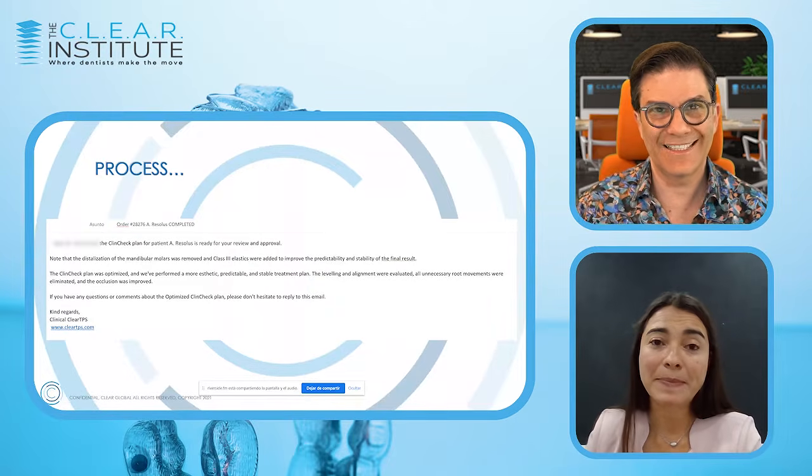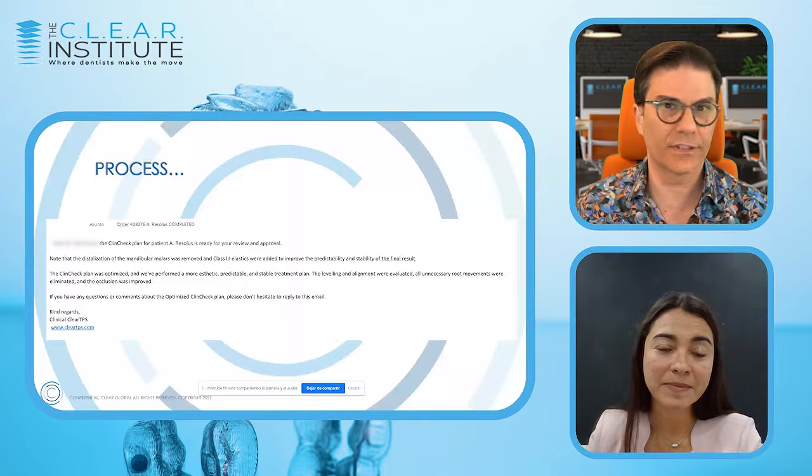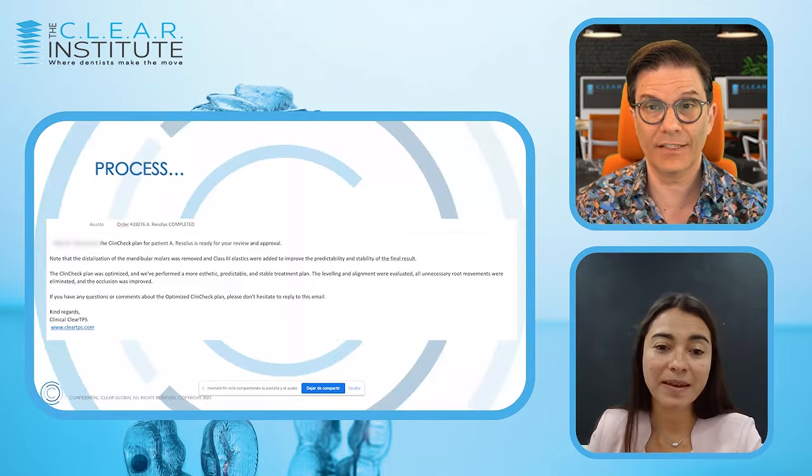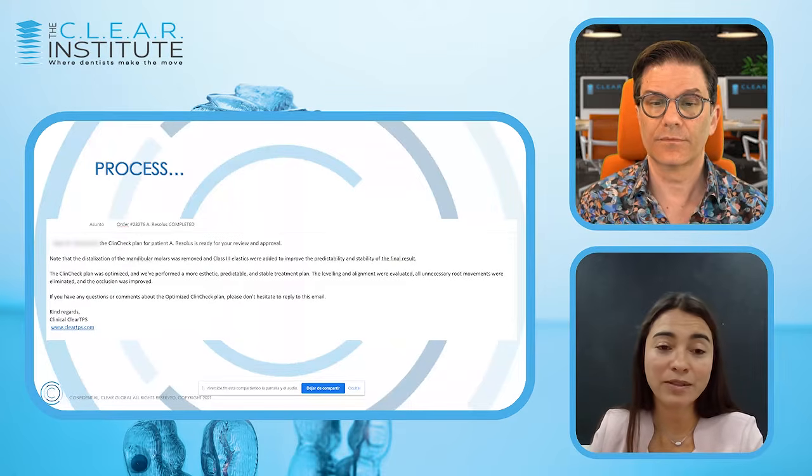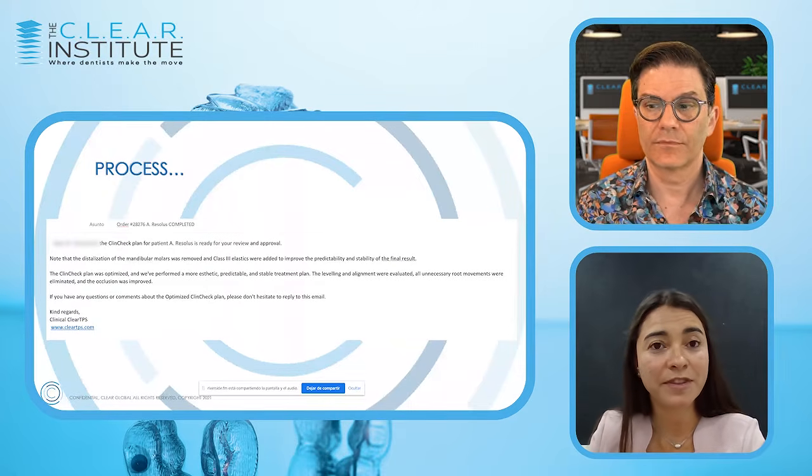And is this included in the service, or is it an additional service if I want to have that? How is it included in the case? How does it work? It's included. The whole process. Okay. It's included within the fee.